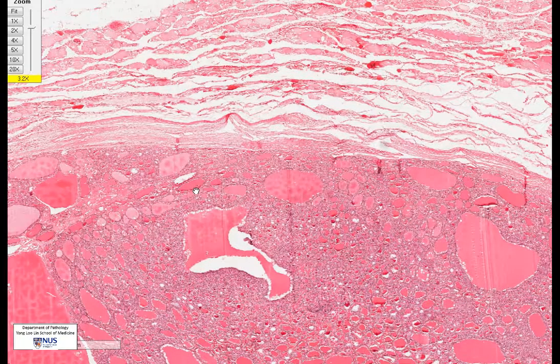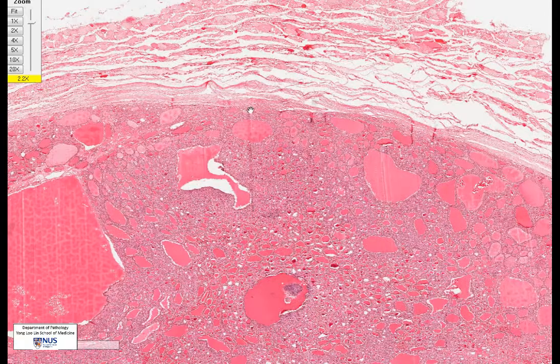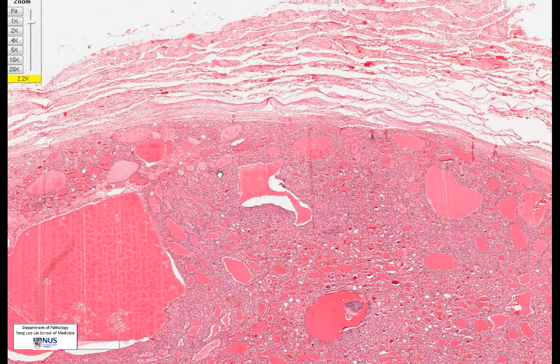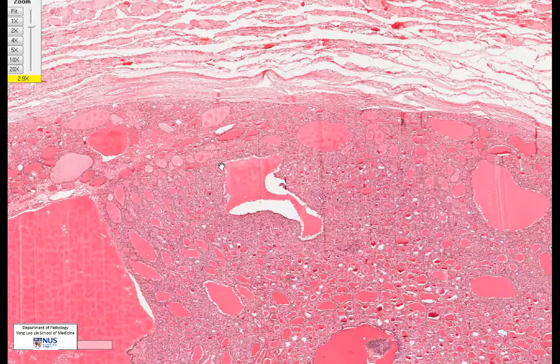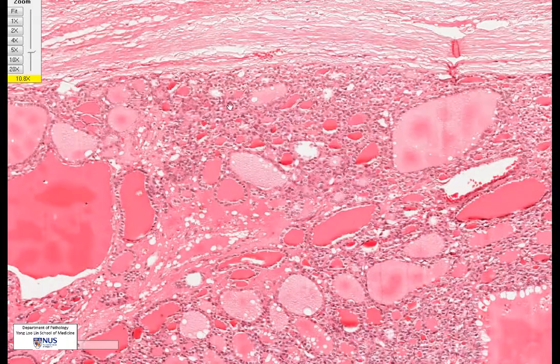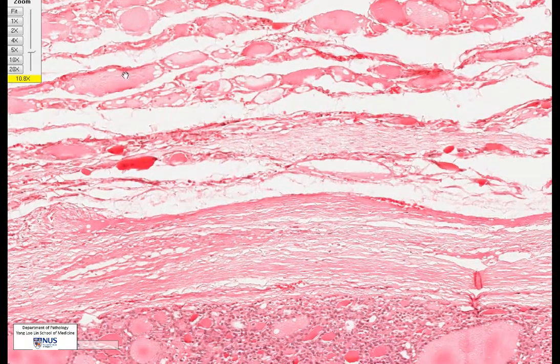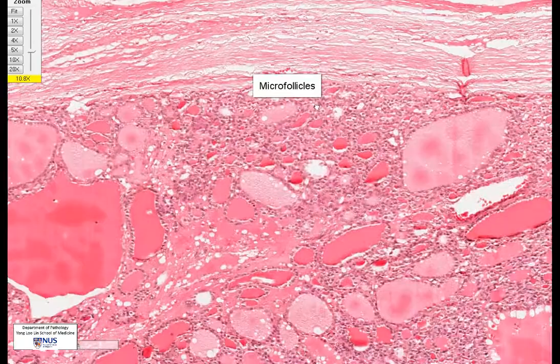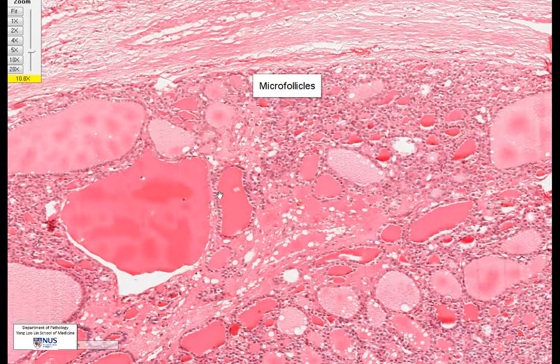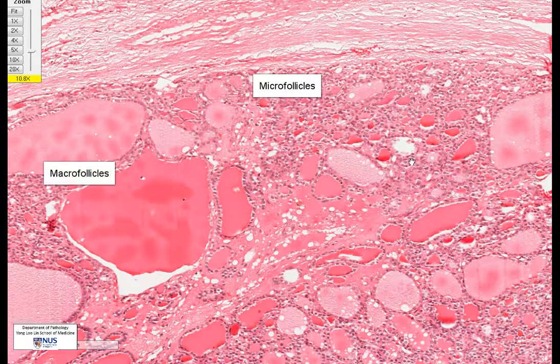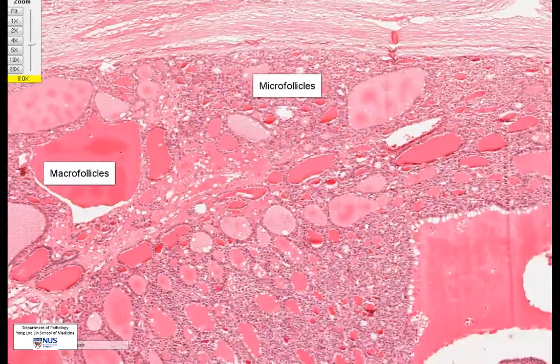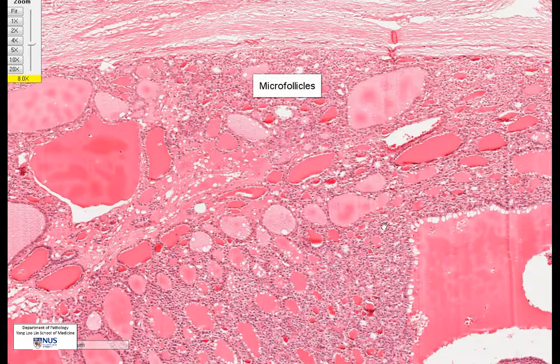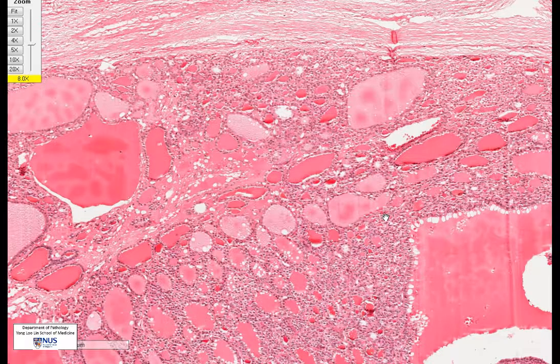Moving back to the area in question, it is very striking that this nodule is extremely different from the surrounding thyroid — this is one feature that favors a neoplasm. At low power, the color appears a little denser because the follicles are a lot smaller, resulting in more packing of the cells. Zooming in, many of the follicles are extremely small — when follicles are so much smaller than normal-sized thyroid follicles, we call them micro follicles. They are also mixed with extremely large follicles, called macro follicles. Overall, the predominance is that of micro follicles, which is another feature that favors a neoplasm.